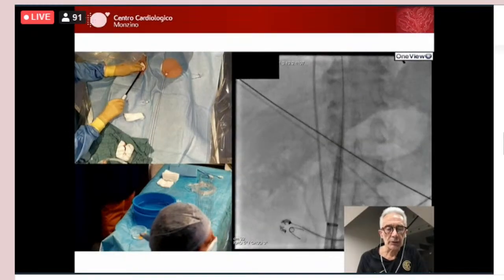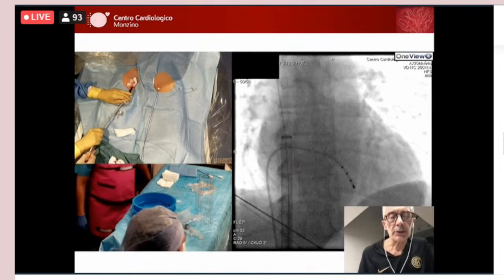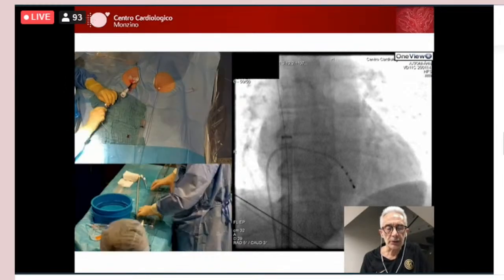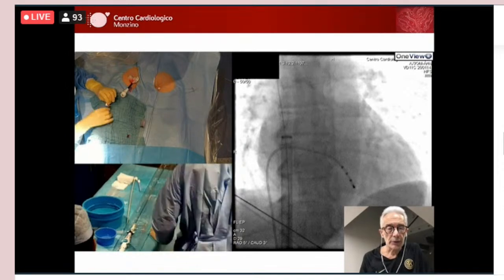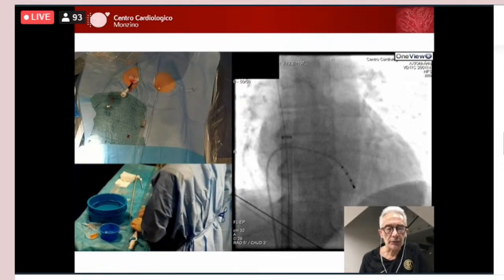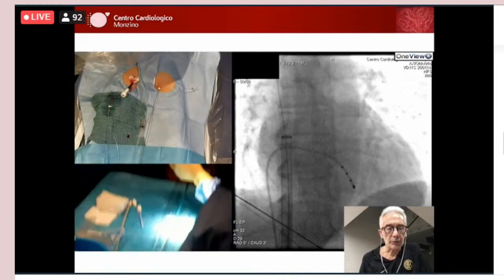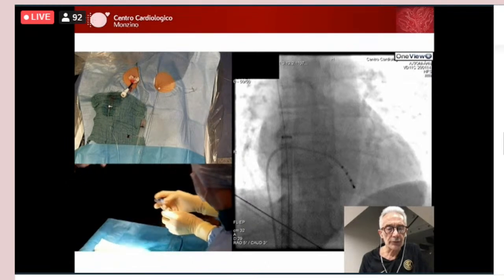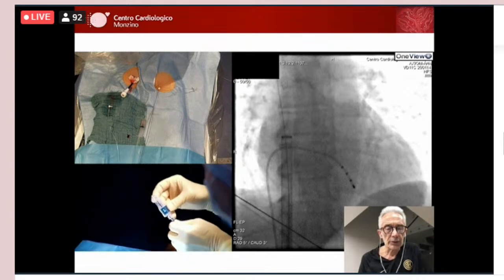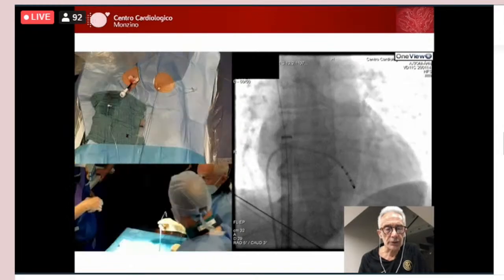And all the way up in the inferior vena cava. Once we achieve the right atrium, we pull the guide wire and the dilator out, and therefore we are ready to advance the AVEIR ventricle. The AVEIR ventricle is not pre-mounted, so we need to attach the device to the assembly. And here we have the example of the device over here. So we attach the device at the tip of the assembly to make sure that device can be advanced into the sheath and finally into the ventricle.